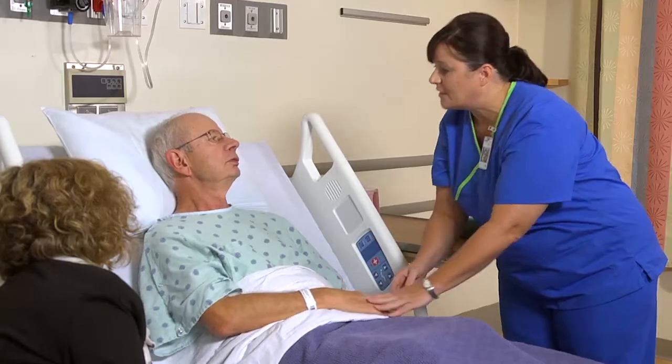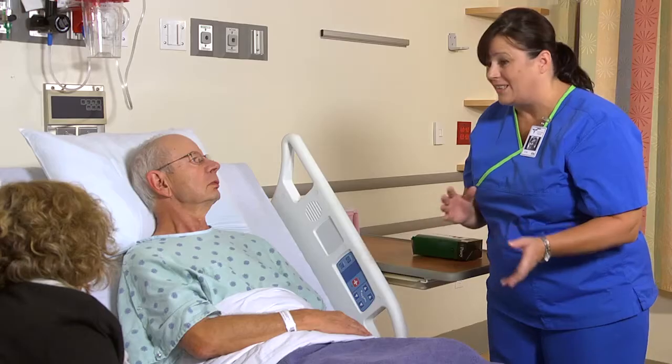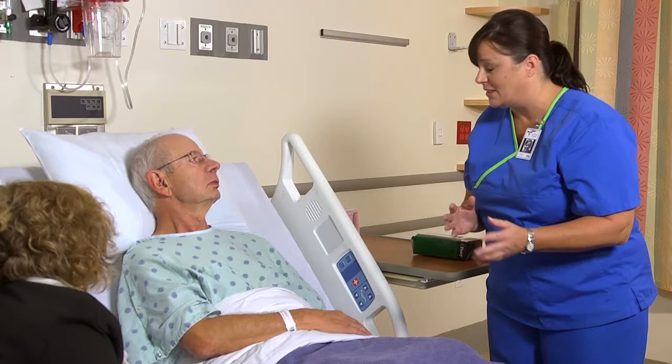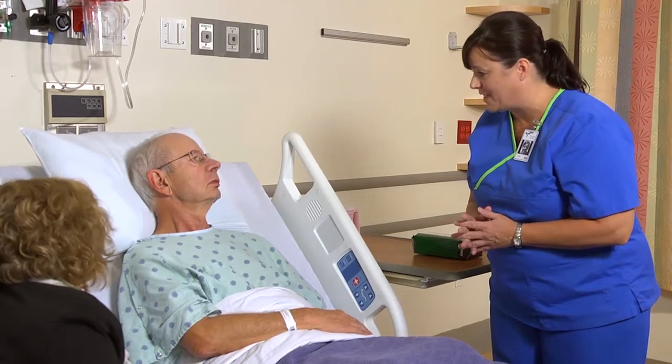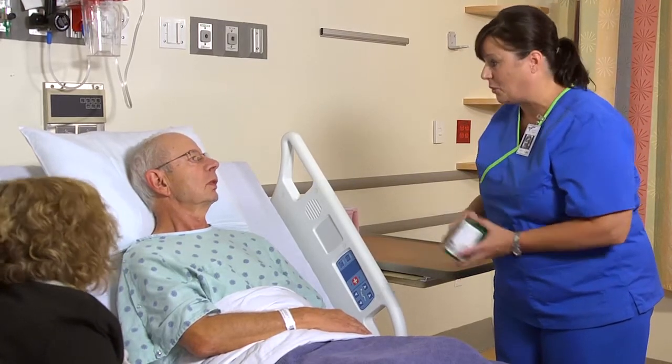Explain to the patient and his family why his health care provider has prescribed the restraint. The physician has ordered a restraint for you. You had surgery yesterday on your ankle and you've been attempting to get out of bed, so we want to keep you safe and we're going to be applying a restraint.